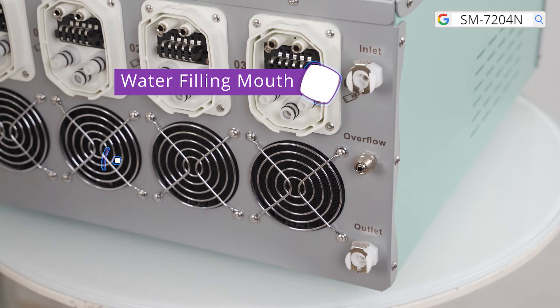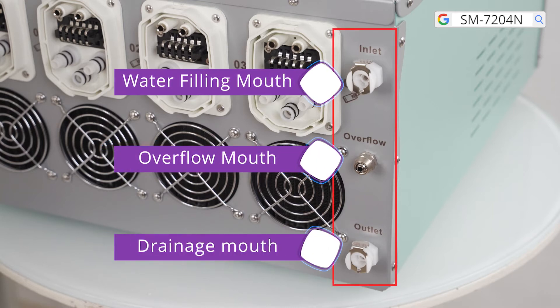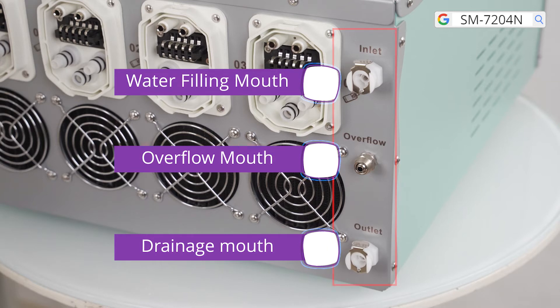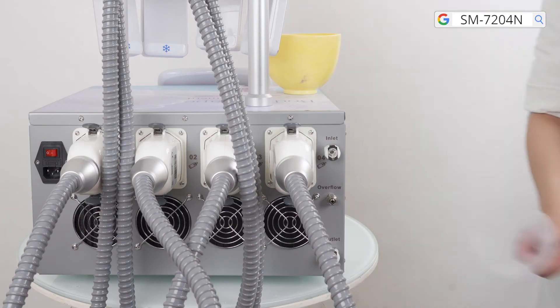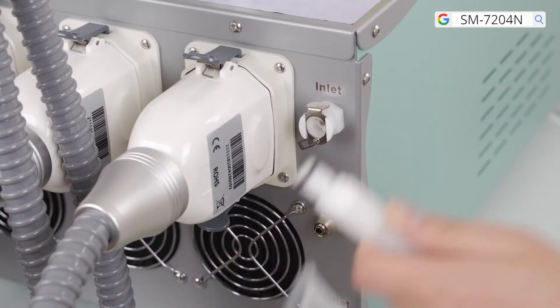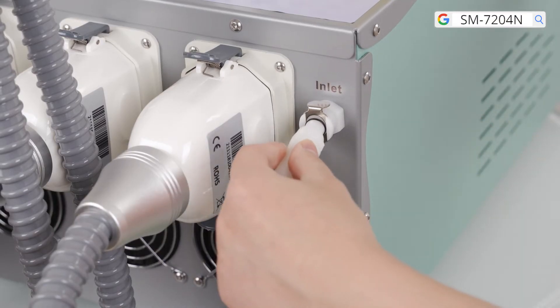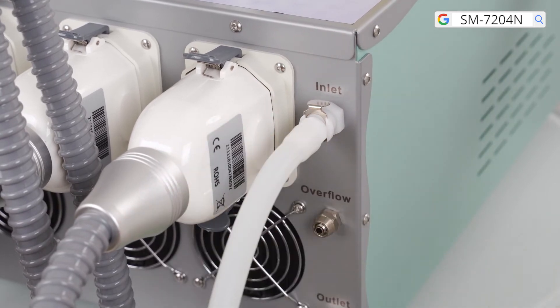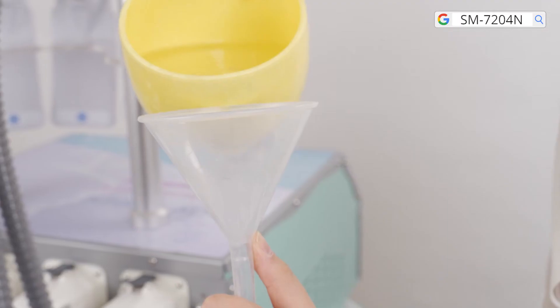There are three holes at the back of the machine: water inlet, overflow hole, and water outlet respectively. Please pour pure water or distilled water in before starting the machine. Connect the hose or the funnel to the water inlet until it is fixed by the fastener, then put water into the machine through the funnel.